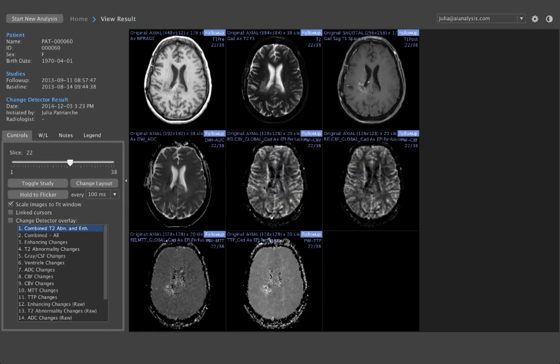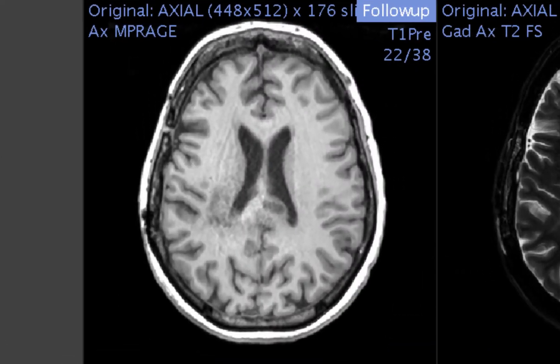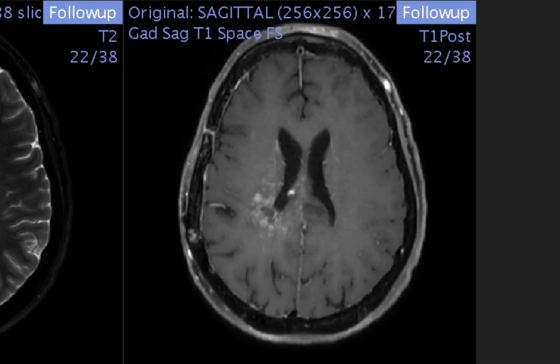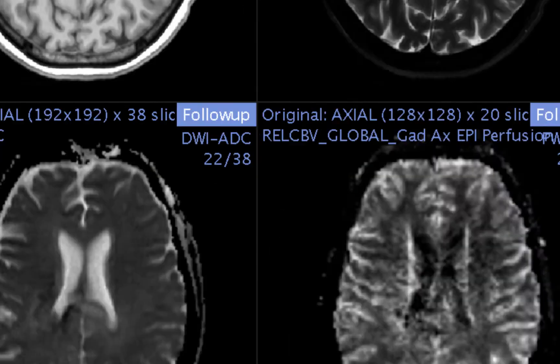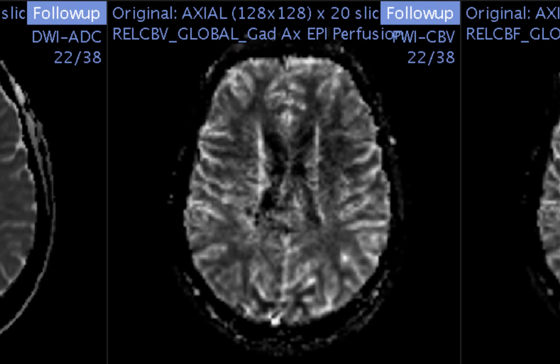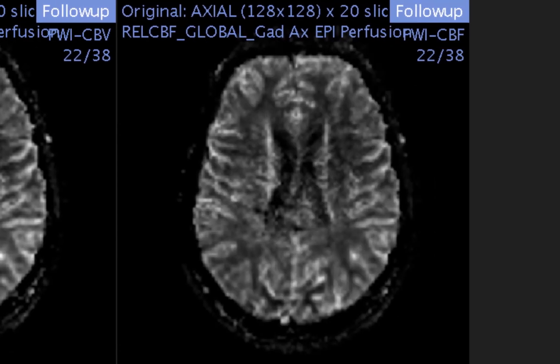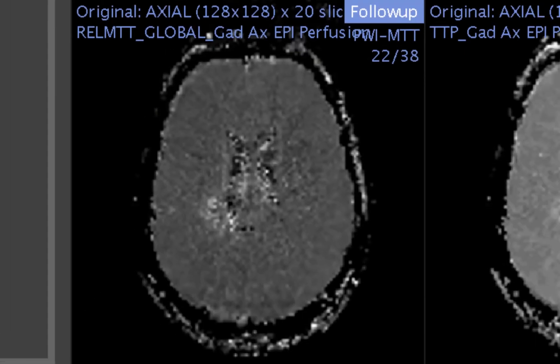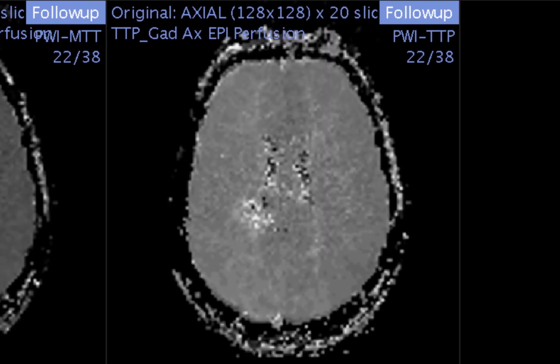The system detects changes in the images that you use: T1, T2, T1 post-contrast, apparent diffusion coefficient, cerebral blood volume, cerebral blood flow, mean transit time, and time to peak.